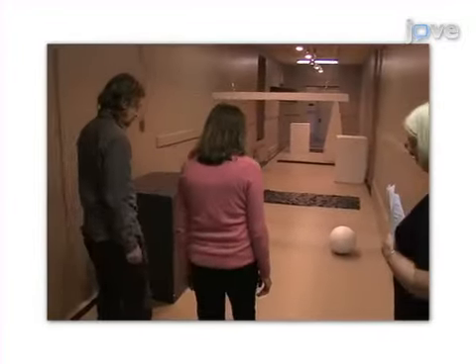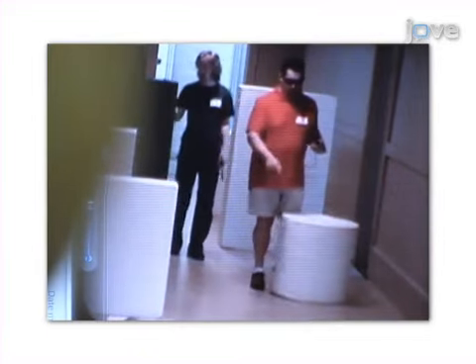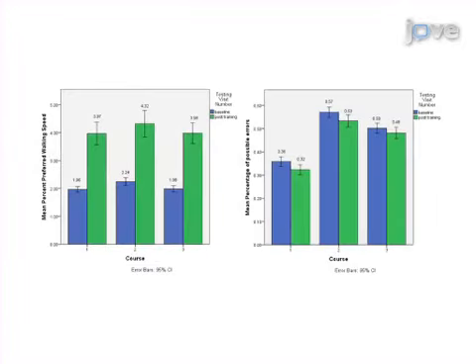After the course is run, the results can be analyzed by examining the outcomes of percent preferred walking speed, the number of collisions and errors, as well as the two visual identification tasks. Ultimately, the portable obstacle course for low vision applications can be used to assess navigation and mobility capabilities in persons with low vision or who are using artificial vision devices.